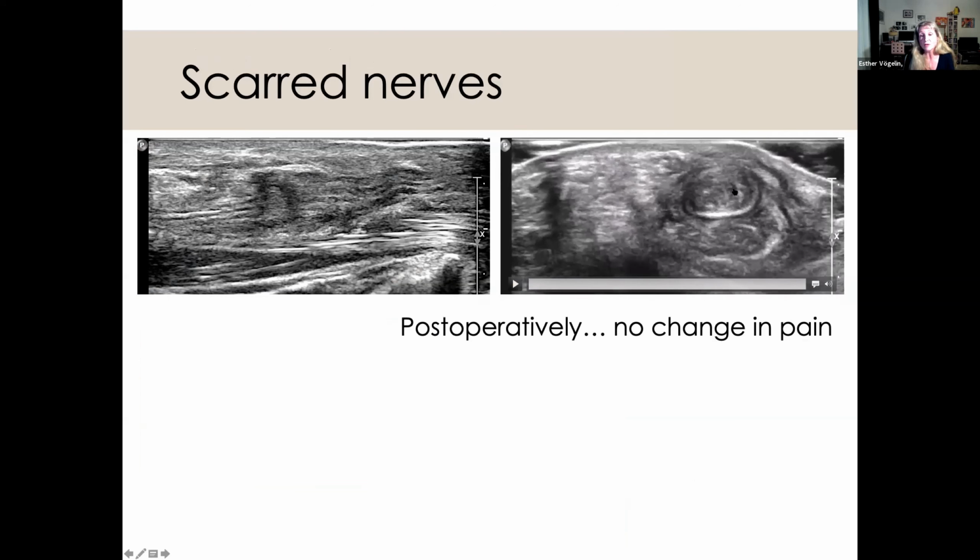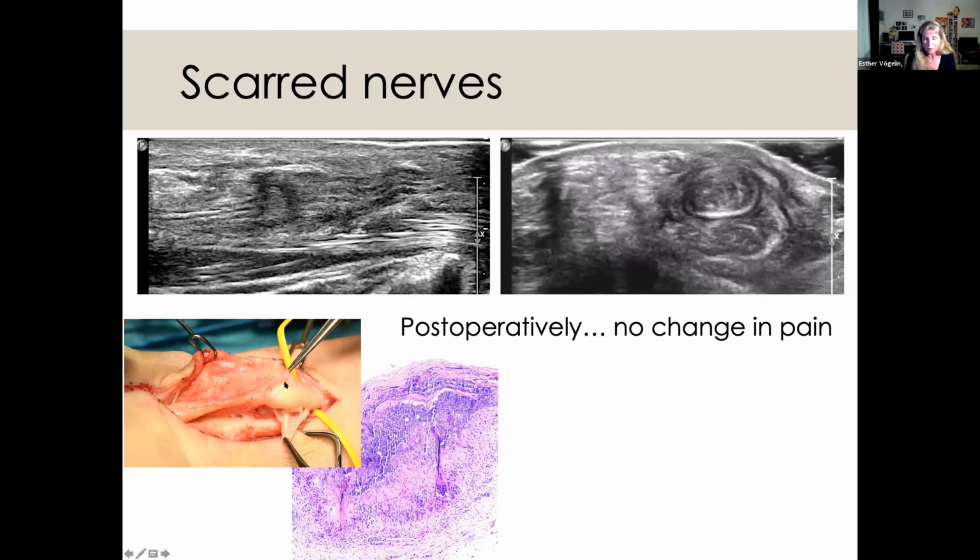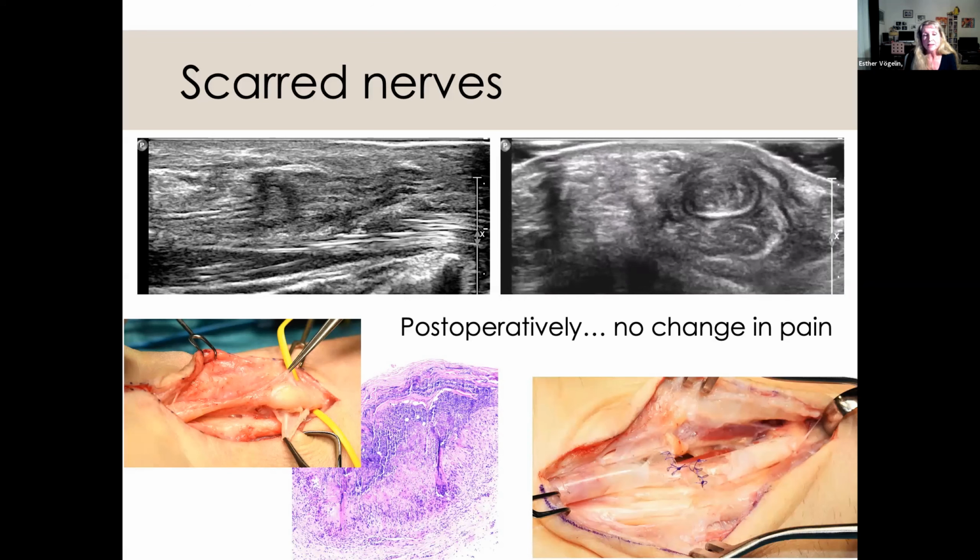And the patient was not better with pain again after this surgery. So we checked again, and this corresponded actually to this area, and we found the necrosis of our nerve graft with, again, a neuroma that was also histologically proven, with actually an inflammatory process. So in this desperate situation, we decided to resect the nerve again and put some caprolactone wrap around it to avoid a new neuroma formation.